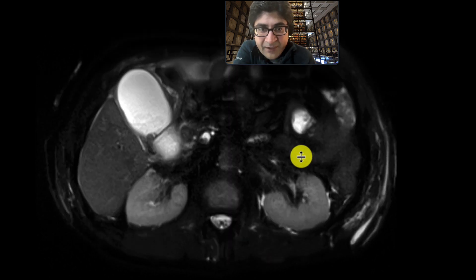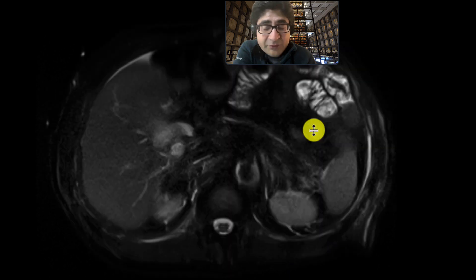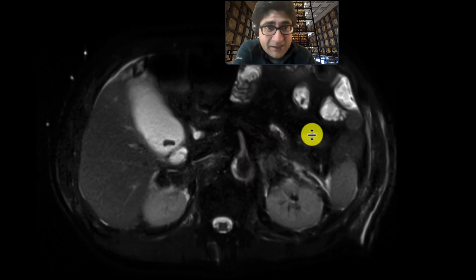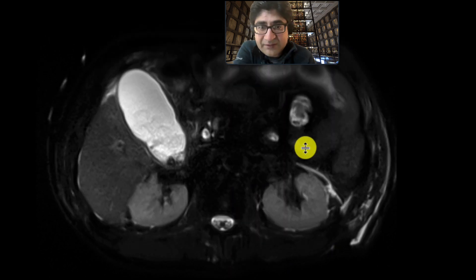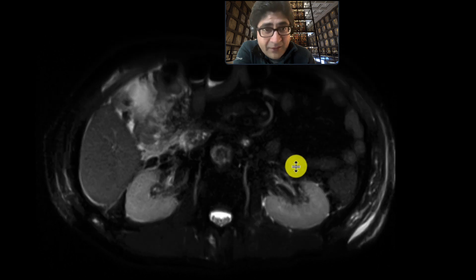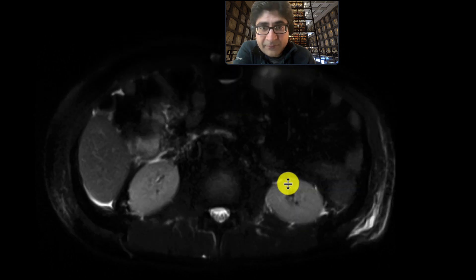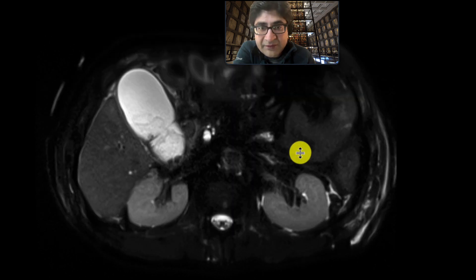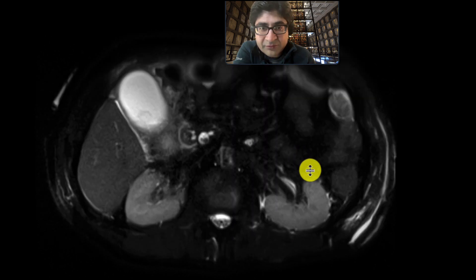These findings are compatible with choledocholithiasis. This is a nice example of acute cholecystitis on MRI, with additional findings of choledocholithiasis resulting in biliary ductal dilatation.